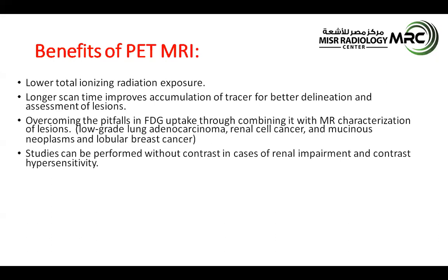There is also the availability and the importance of the fact that we can perform a PET MR study without the need for MR contrast agents in patients with renal impairment and contrast hypersensitivity, giving us accurate data based on the non-contrast enhanced perfusional and diffusional sequences.